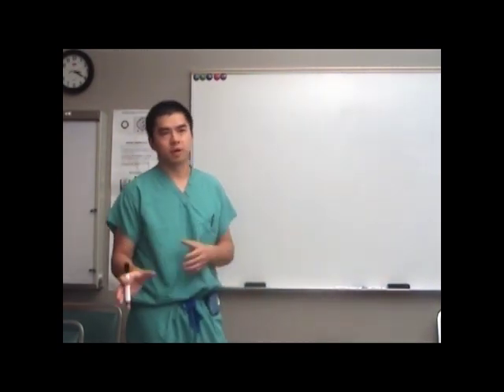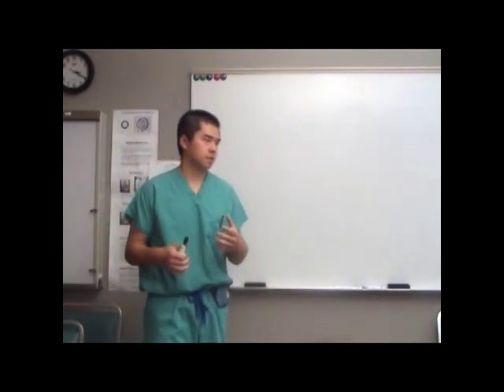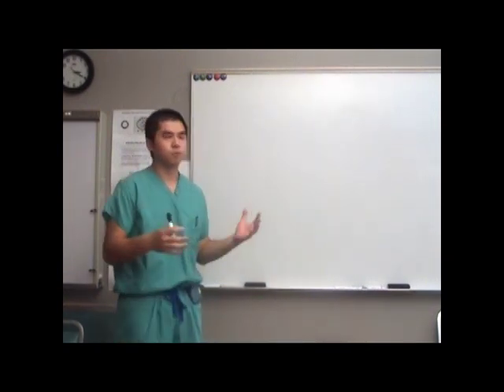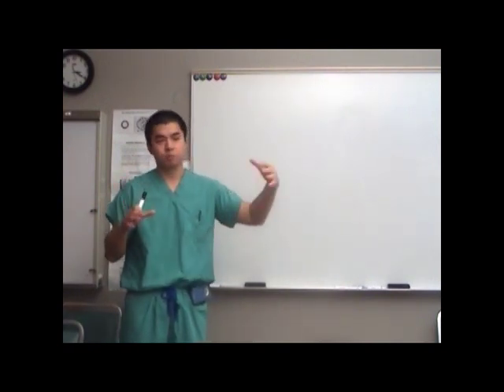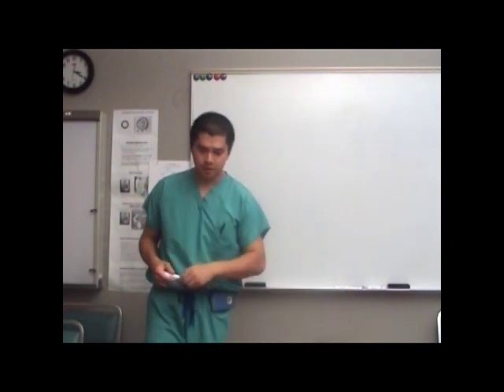The patient with IUGR is obviously higher risk, and you're going to be more concerned about something like intermittent variables than in someone who's healthy with a normal pregnancy. So always remember to determine your risk and interpret your fetal heart tones in context of the patient that you're taking care of.